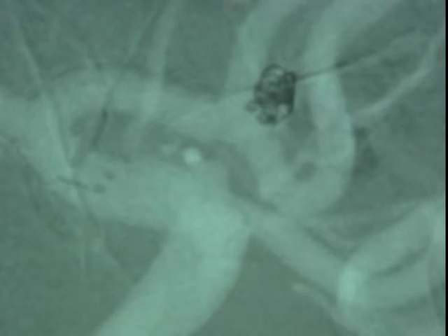One of the coils is now released and being removed from one of the catheters. The catheter is left in place in the aneurysm, so additional coils can be placed. Another coil is now being placed into the aneurysm to further fill it.